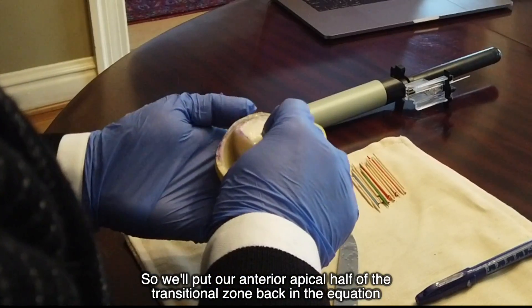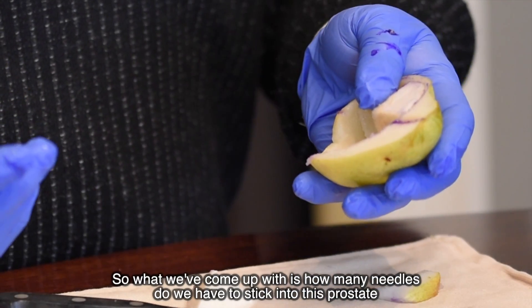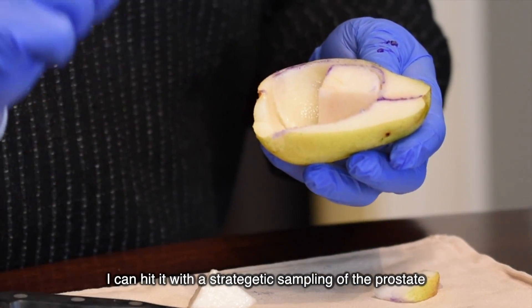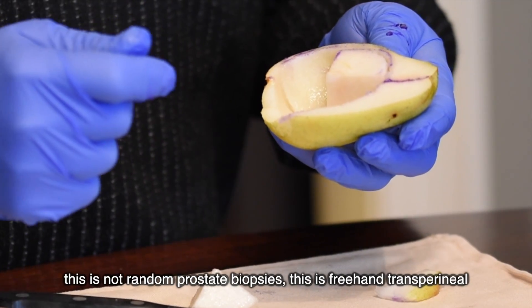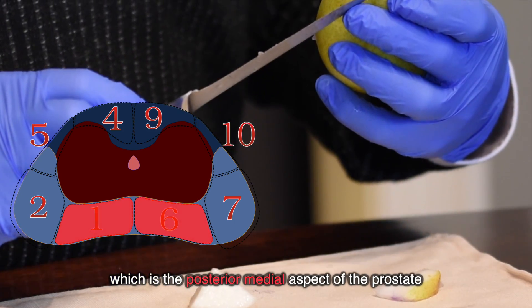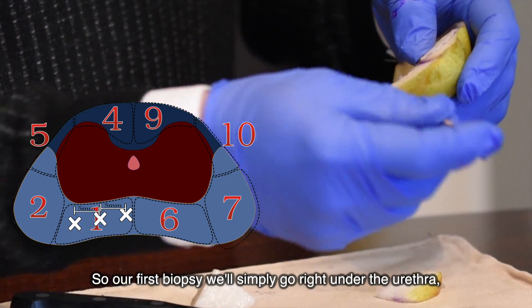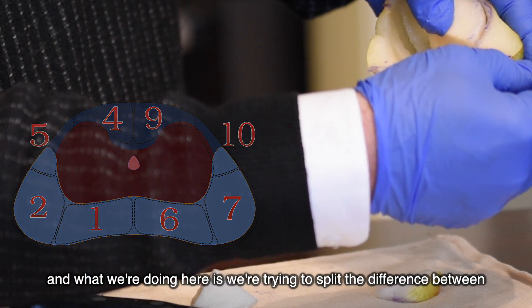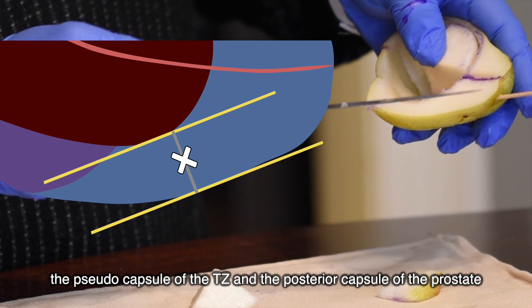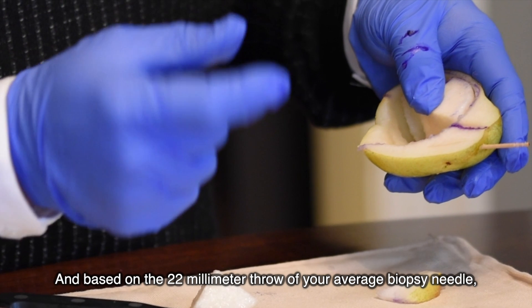We put our anterior apical half of the transitional zone back in the equation, having removed the CZ. Here is all the PZ. The question becomes: how many needles do we need to stick into this prostate so that if I was hiding a six-millimeter lesion anywhere within the prostate I can hit it? This is strategic sampling, not random prostate biopsies. The first sector is the posterior medial aspect — roughly under the urethra, in five-millimeter increments lateral. The first biopsy goes right under the urethra, splitting the difference between the pseudo-capsule of the TZ and the posterior capsule.